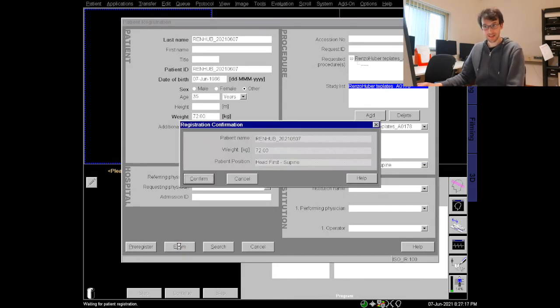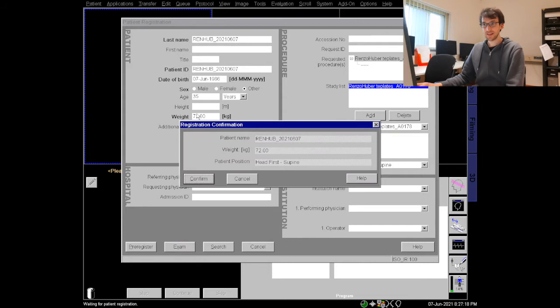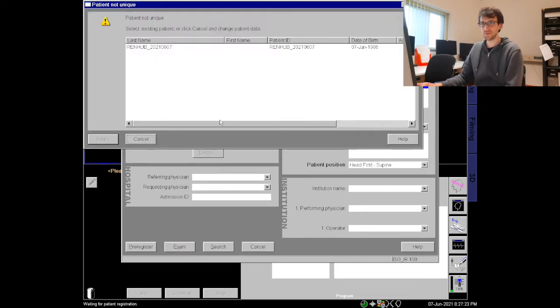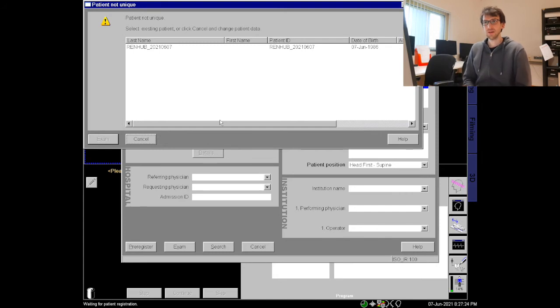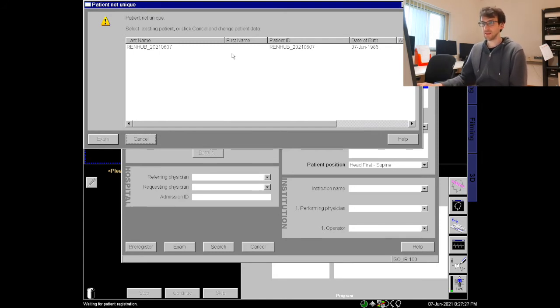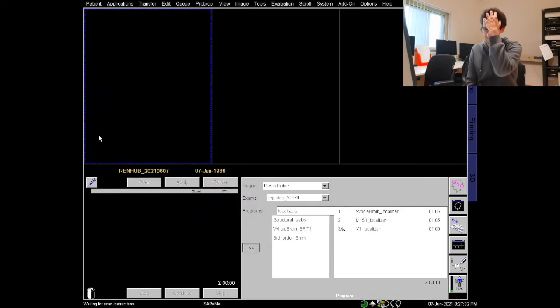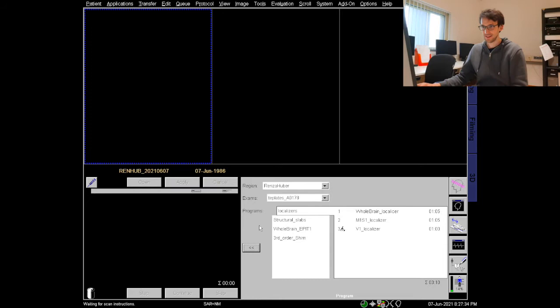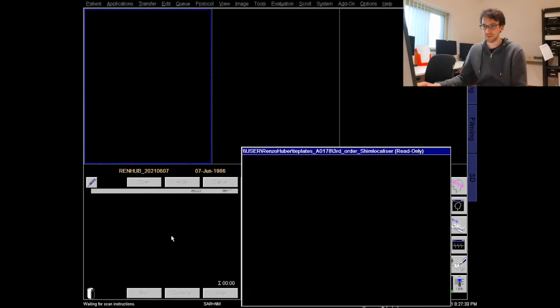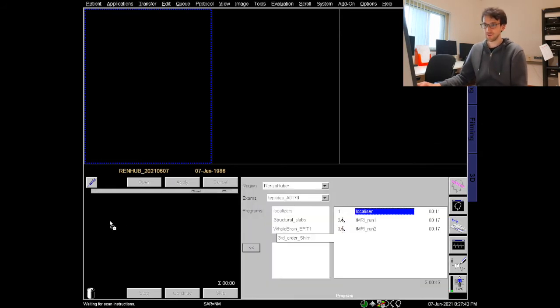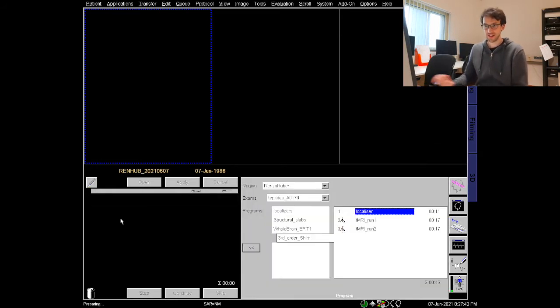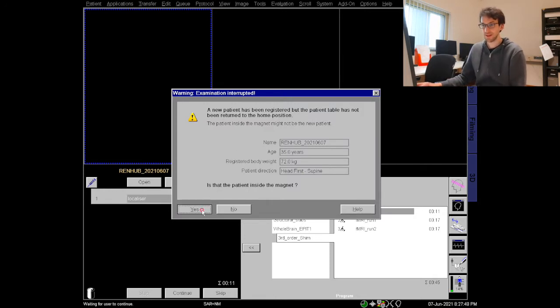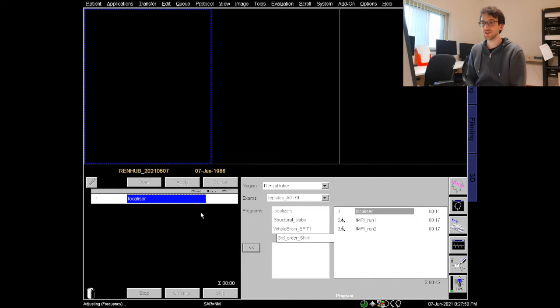So we can start exam and it will ask me to confirm the most important parameters, particularly also if this participant has been registered already we can combine them. You probably know these kind of procedures. Now we can start our localizer just to get an approximate orientation where our participant is lying. For that I just drag and drop our localizer into our queue and again I confirm that this is my participant even though I did not move the table.